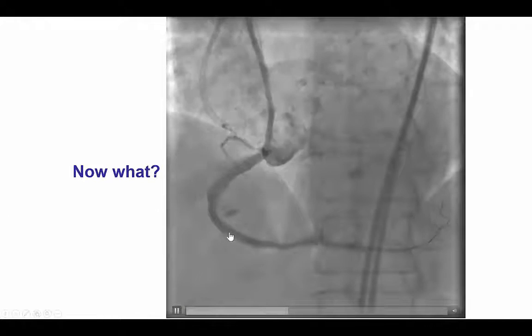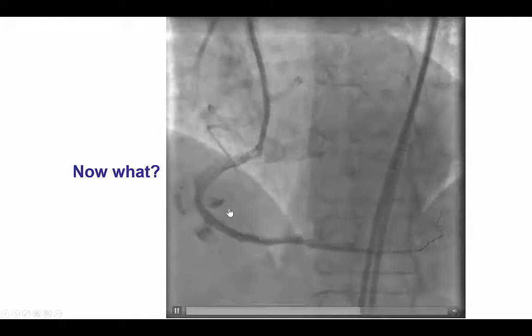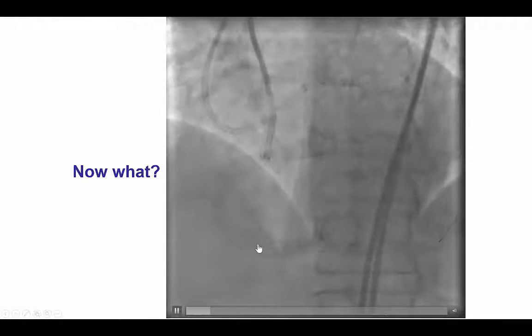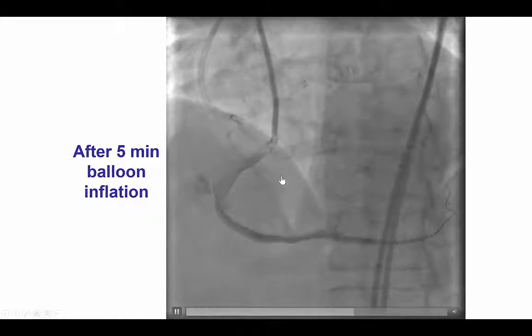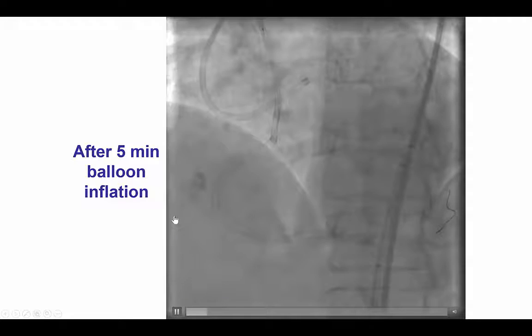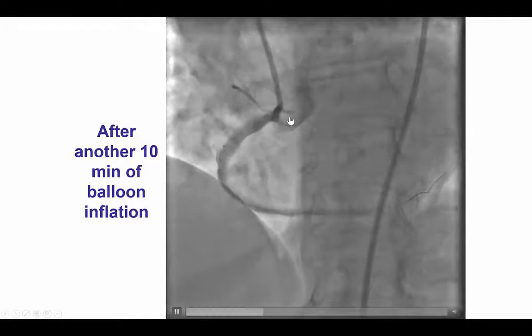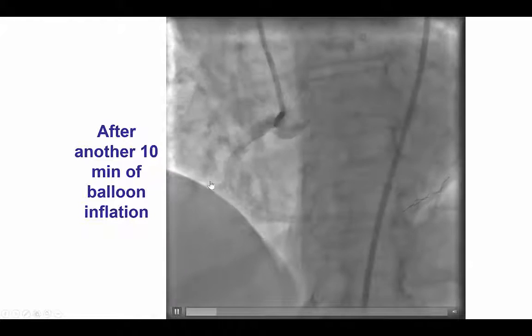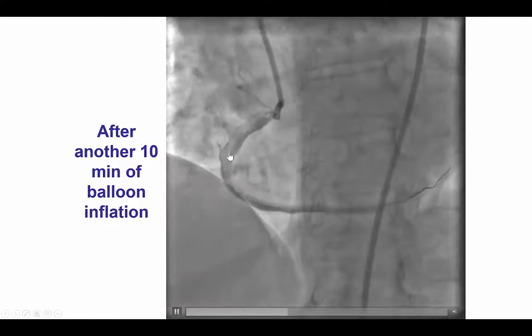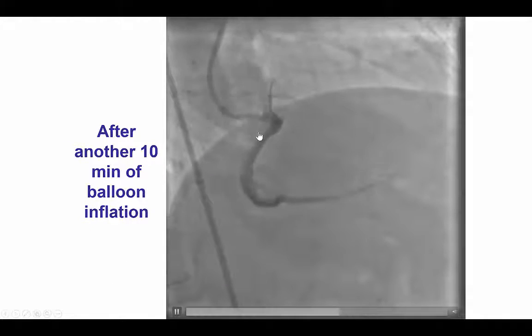There was a perforation in the middle part of the right coronary artery with contrast coming out of the vessel. We immediately inflated a balloon to stop the extravasation. After a few minutes of balloon inflation, the perforation looked much better — there was still some stain, but much less brisk bleeding into the pericardial space. We were not able to advance a covered stent because of severe calcification. However, after another 10 minutes of balloon inflation, there was no recurrent bleeding into the pericardial space, as confirmed by two orthogonal projections.